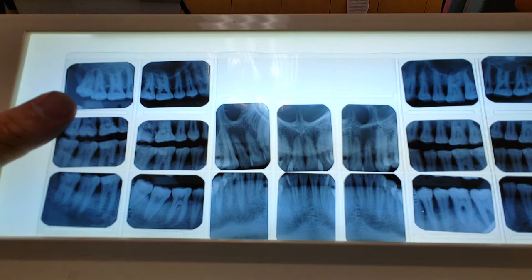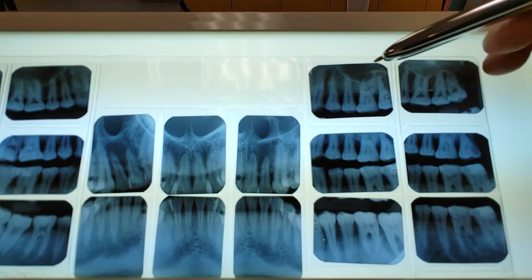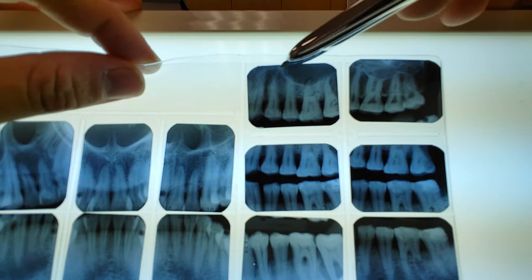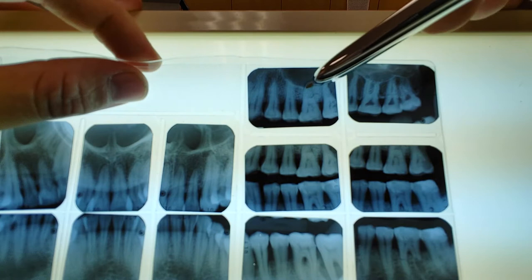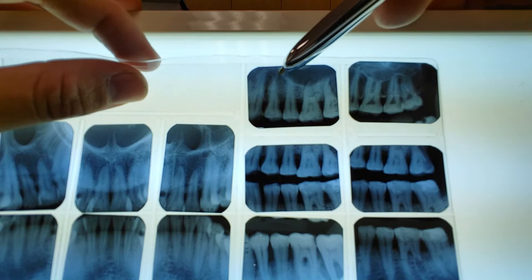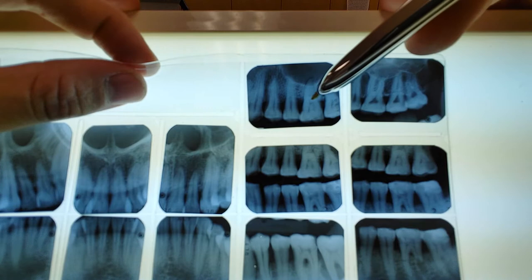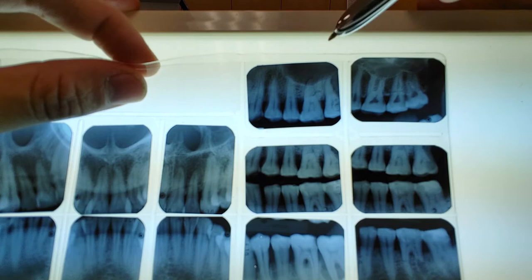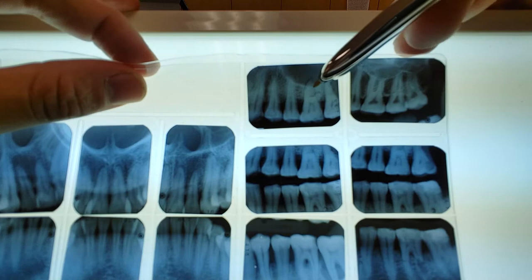For the other maxillaries, let's go to the back molar area. This is my patient's upper left molar, and we have this oval shape — that's going to be our maxillary sinus, hovering right above where our molars are and slightly above the premolars. We look at where our root tips are in reference to how deep we can go into this area — for example, when a doctor is trying to extract a tooth or place an implant, they need to see how far they can go before reaching the maxillary sinus.